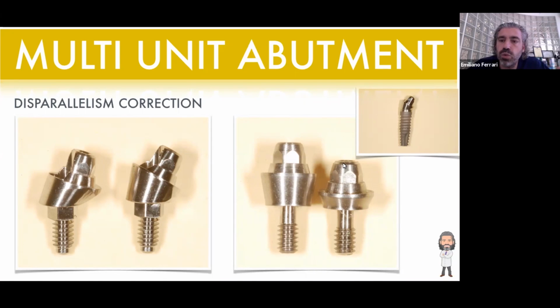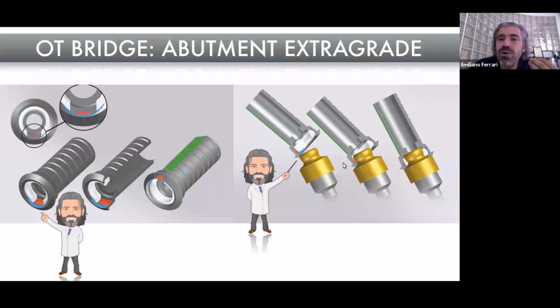And that's what we can do using the Equator. But how can we do that? We can do that by changing the shape of the secondary abutment, the abutment that you couple with the Equator, the one that stays inside the rehabilitation. The secret is those wider areas that you have on the platform of the secondary abutment, marked in red and blue here.